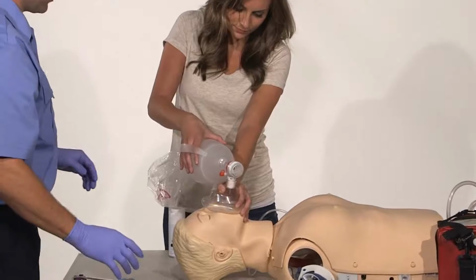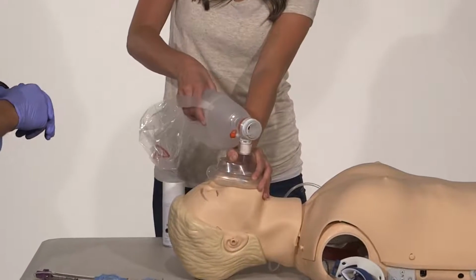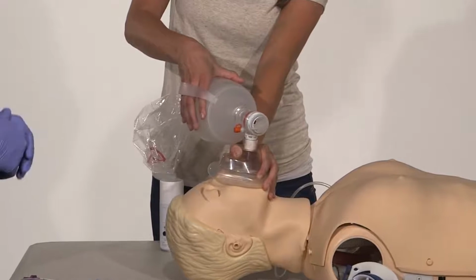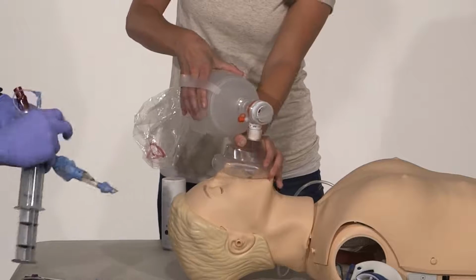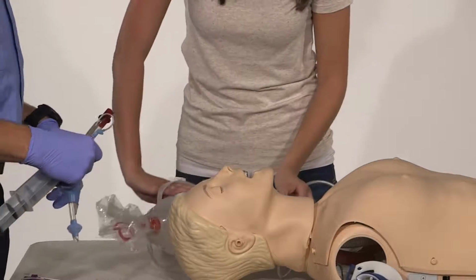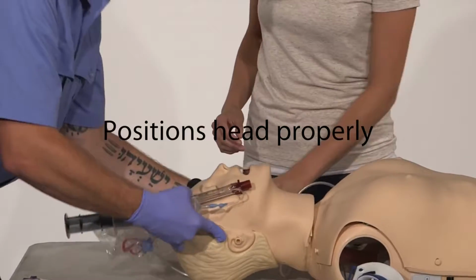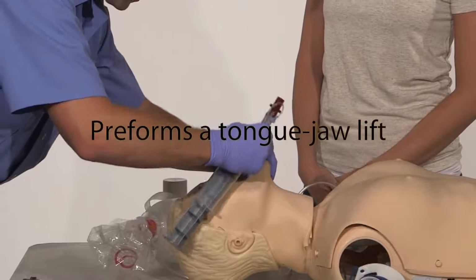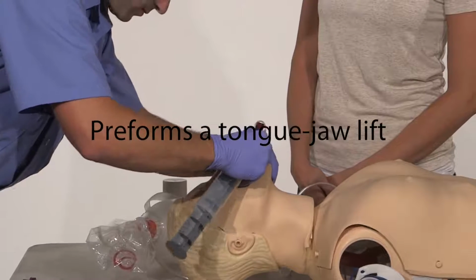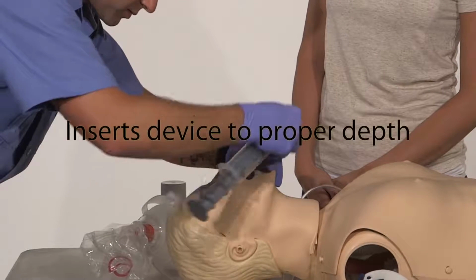When I instruct you, I want you to remove the BVM and the OPA from the patient. So after your next breath, go ahead and remove the BVM and the OPA. Okay. Tilt the head, place that in there. Place it to the correct depth. Oops.